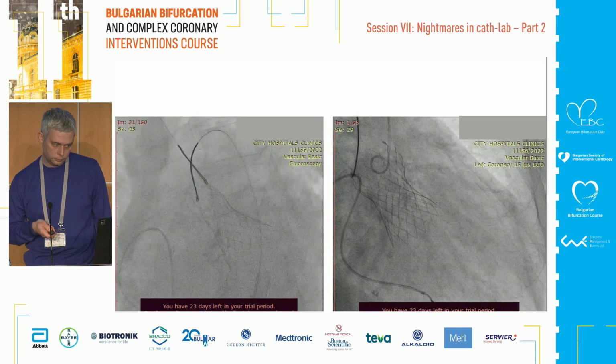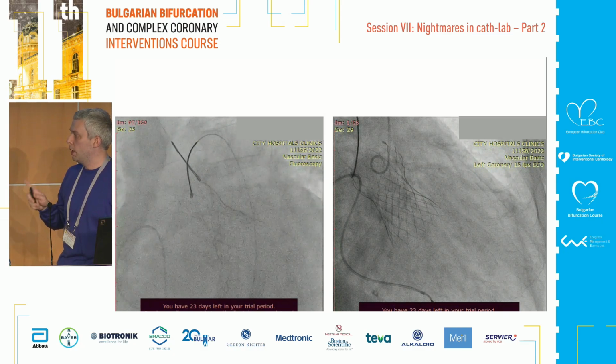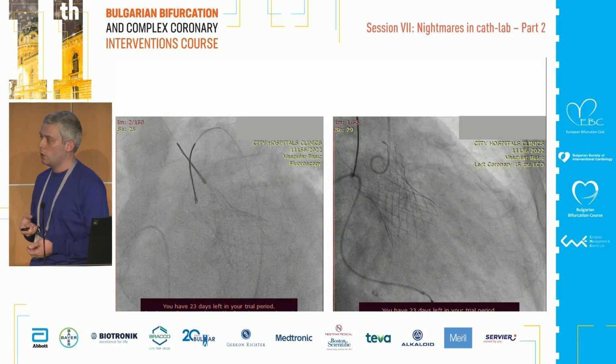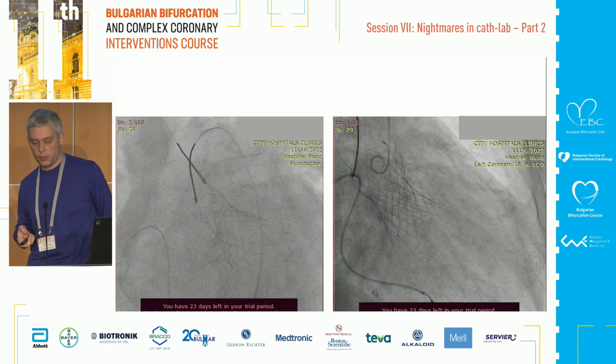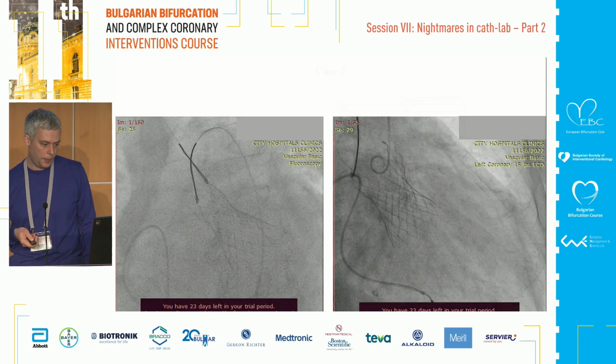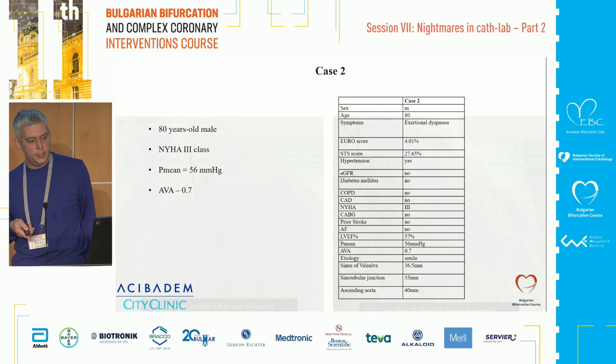Did you redilate this valve or not? No, no. There was a predilation of the native valve before, but there was no attempt at post-dilation because we think that this will not help in such deep implantation of the valve. No. After removal, recapture of the valve? No. This is the result.